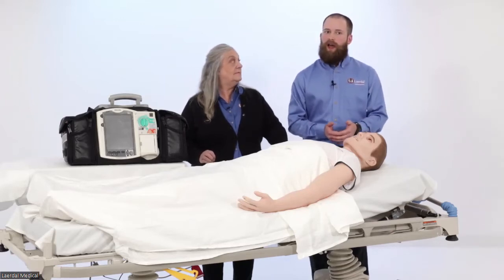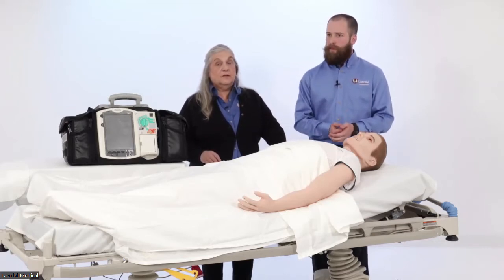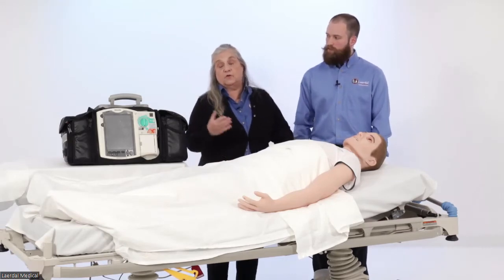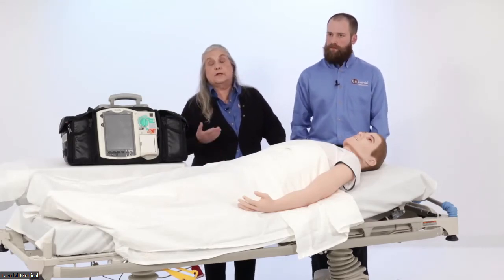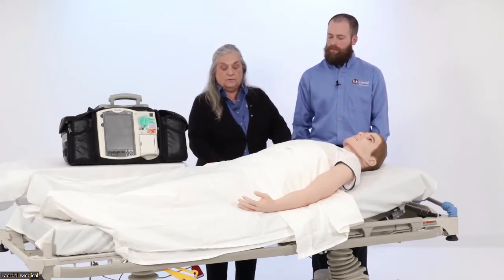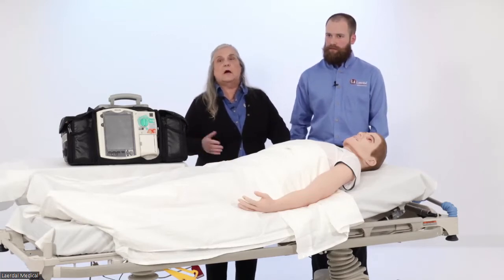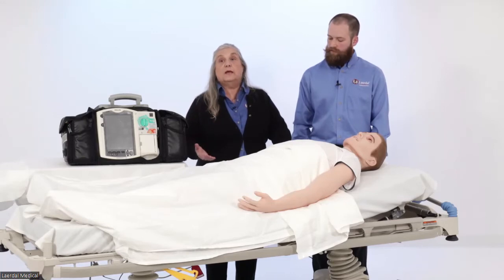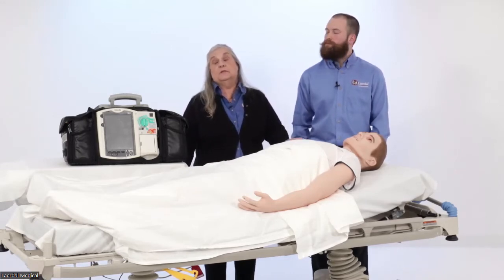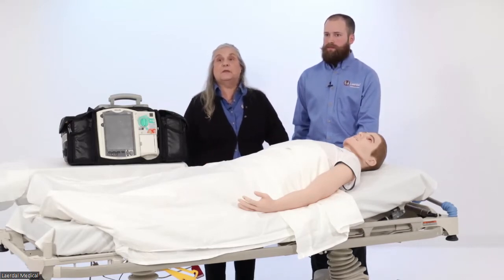You can still use that as long as you use the 3G arms. So same with the blood pressure as well. You can also cannulate the arm using whatever appropriate syringe that you would use for a person. And once you cannulate it, you can attach a saline lock and use it to administer medications. It still drains out the back of the arm, so you can catch it in a bag, an IV bag or something.